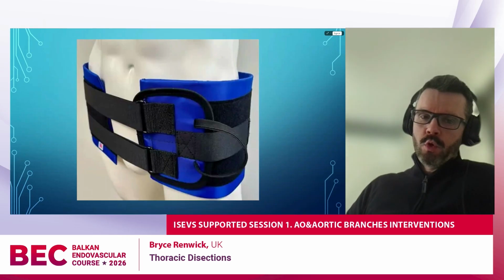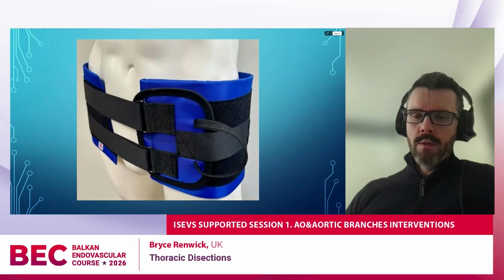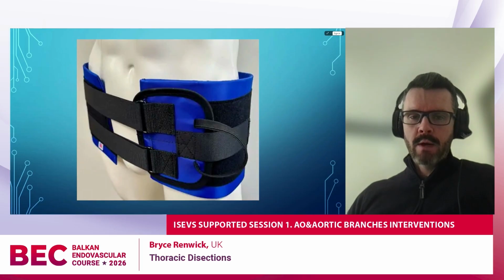And so these patients almost always end up with a pelvic binder, and this is standard practice in shattered pelvis trauma, and these are supposed to go on centered over the greater trochanters. Now, as you can see with this mannequin, getting to this patient's femoral artery might be quite a challenge, and in fact it becomes really hard work when you need to get a thoracic stent graft into them.